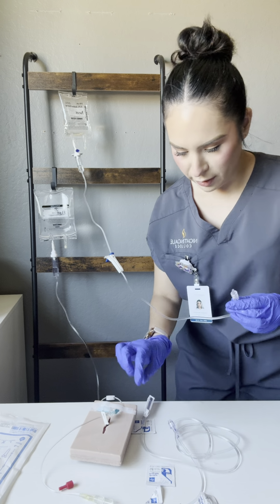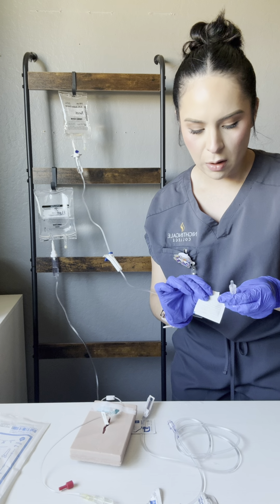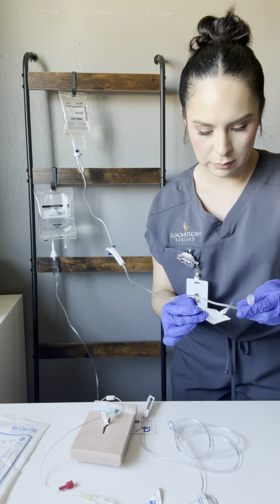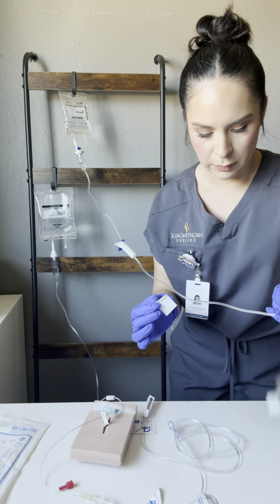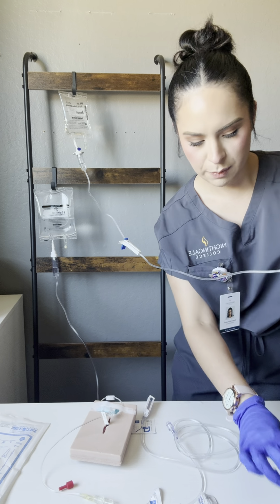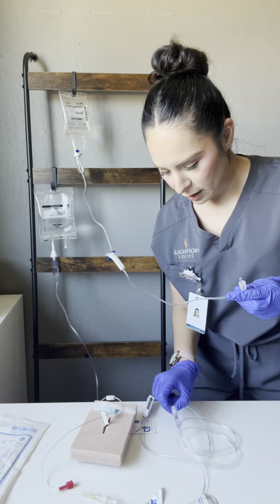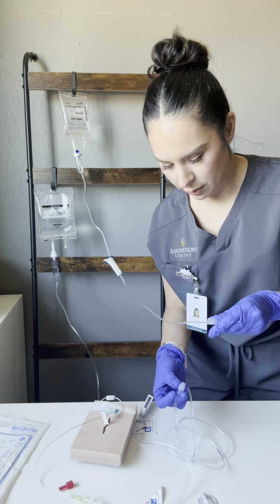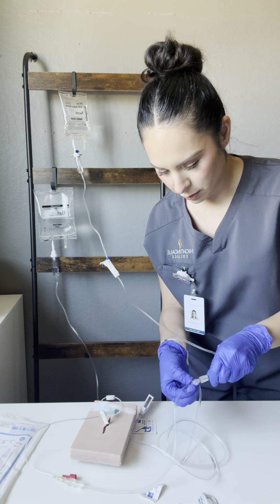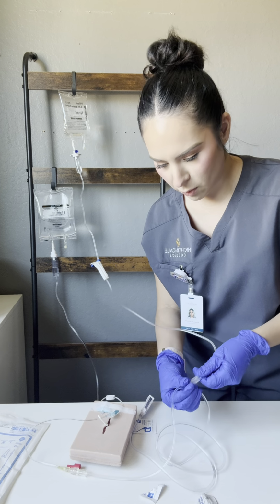And then we are going to want to clean the Y site port with an alcohol pad. We're going to dispose of that and let it air dry for 1 minute. And then we are going to attach our tubing to the Y site.